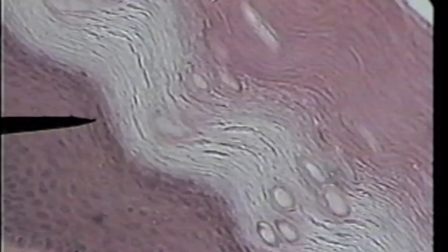Thick skin has a very thick layer of keratinization. Now we'll look at thin skin. This is keratinized stratified squamous epithelium found in thin skin. The tip of the pointer is at the base of the epithelium.